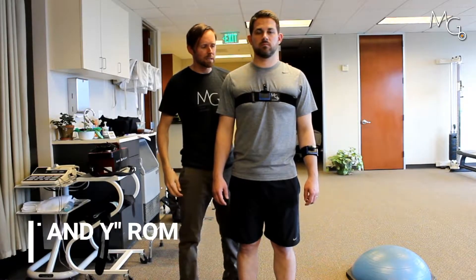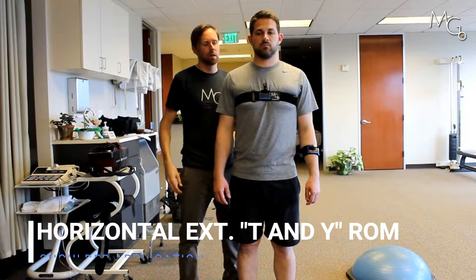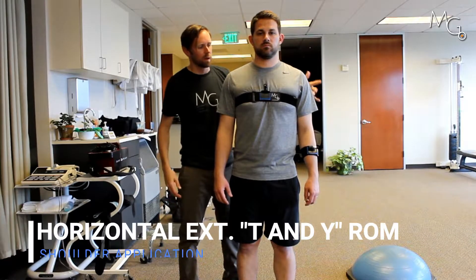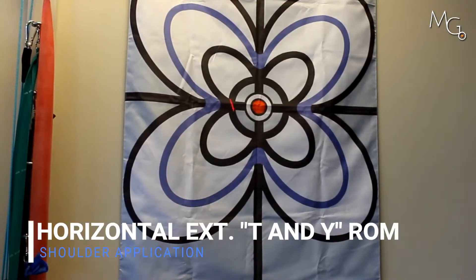Another way we can look at shoulder range of motion without thoracic compensation is by adding two lasers — one around the thorax and one around the shoulder. We're going to turn the one on the thorax on and center it up on the target.